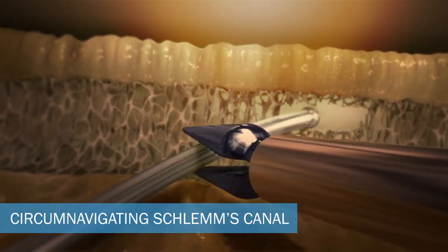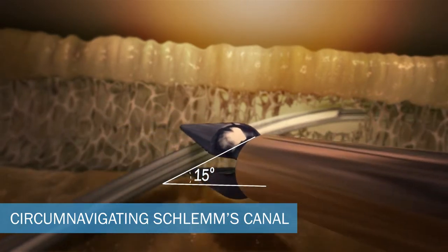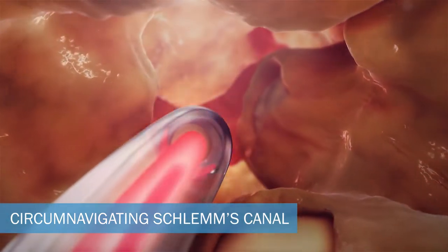Place the EyeTrack into Schlemm's canal at a slight upward 15 degree approach using the RPT all-in-one forceps. Once intubated, the canal will be circumnavigated 360 degrees.